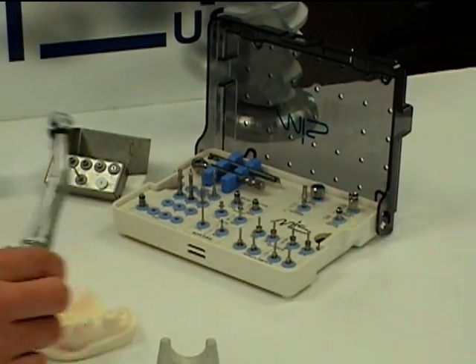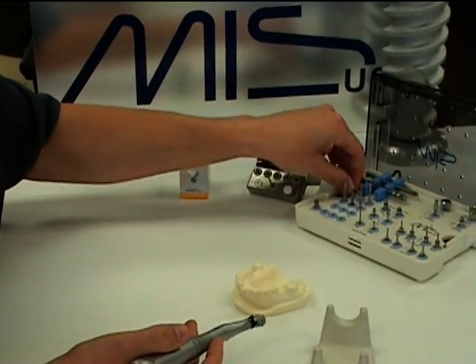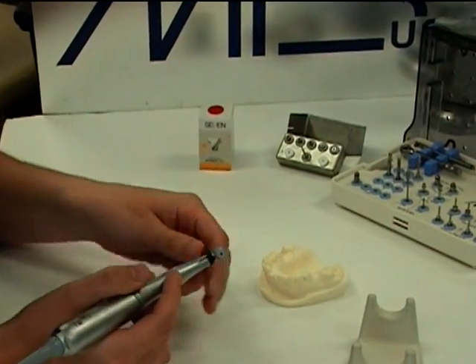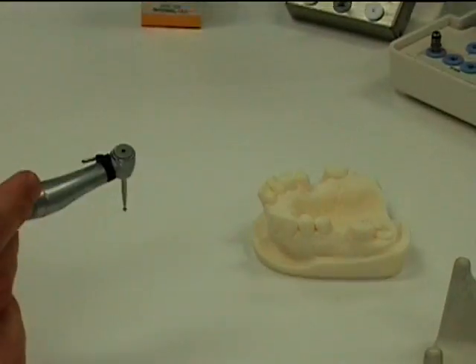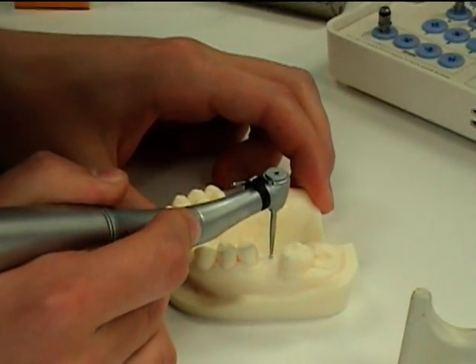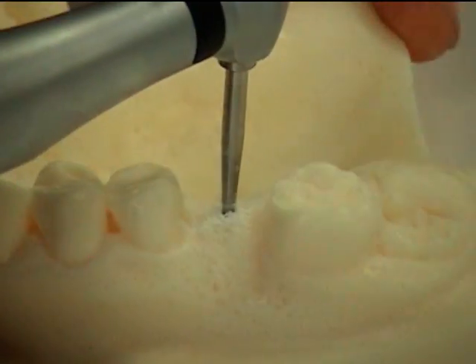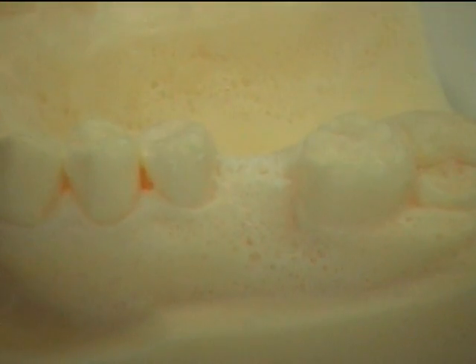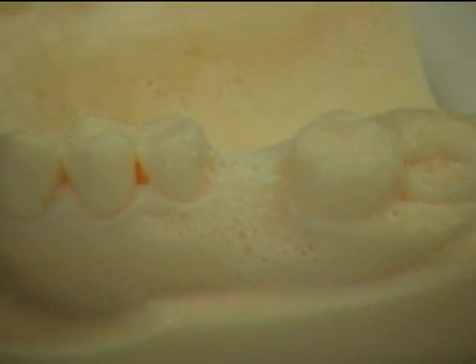So to begin, first we need to use a marking drill to create the spot where we're going to drill our osteotomy.